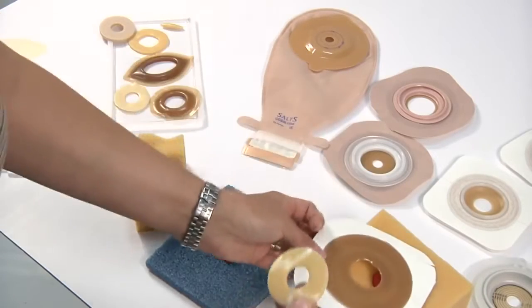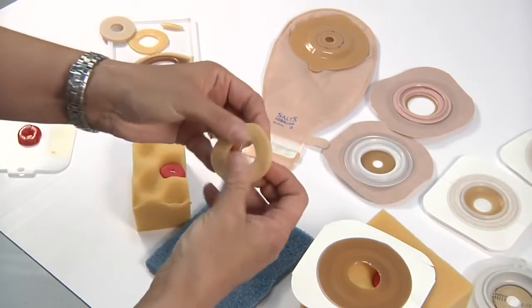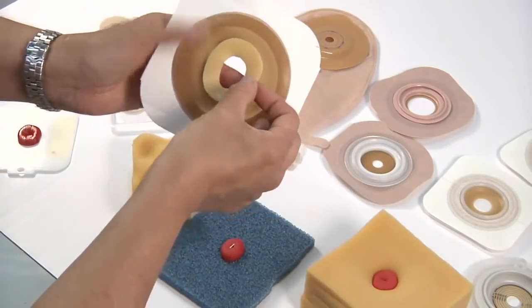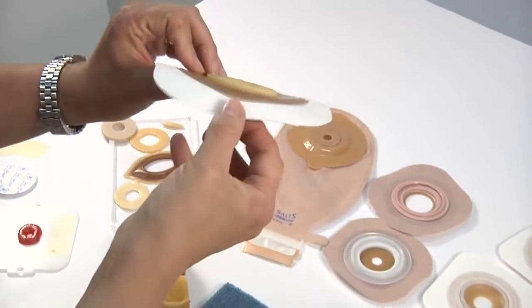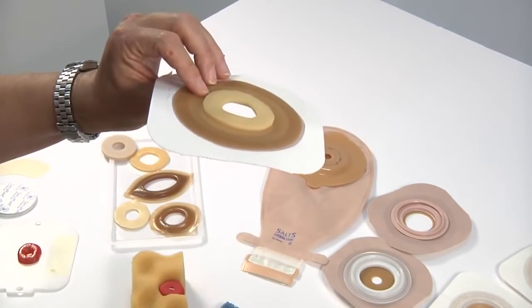So you would pull your ring out to the size and shape of your stoma. You would put it on the back of your barrier like this, okay? And already, if we go by what the definition is, that it's some degree of protrusion on the back of the barrier, you've achieved a very low level of convexity.